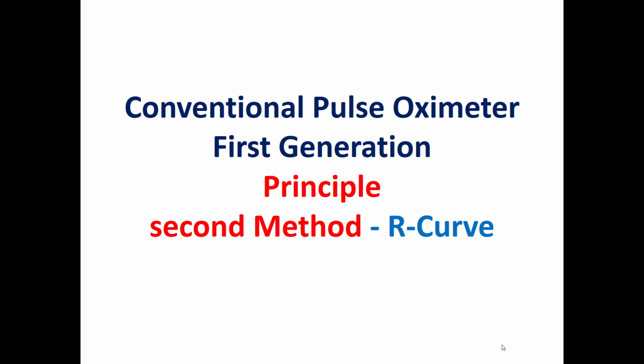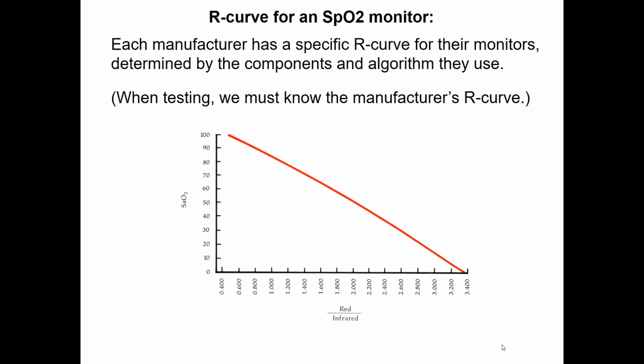Another method, which is more accurate and replaces the previous method, is the use of the R curve.